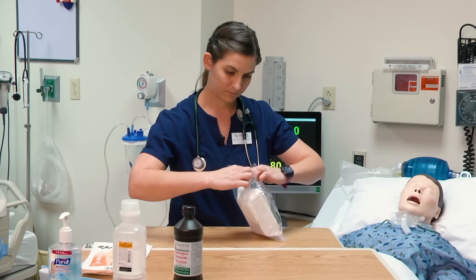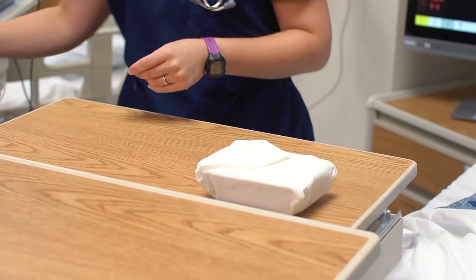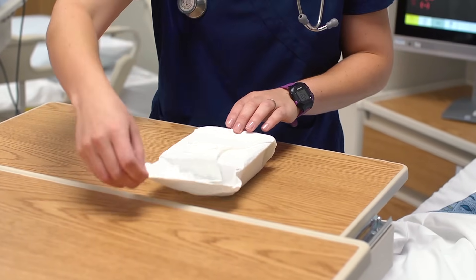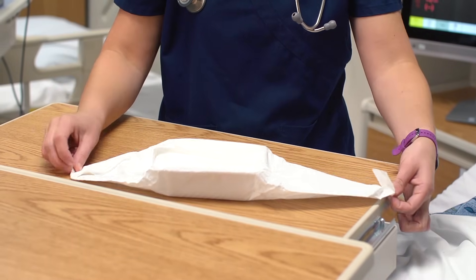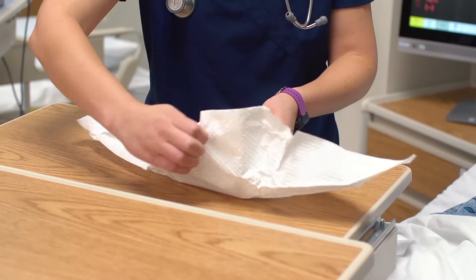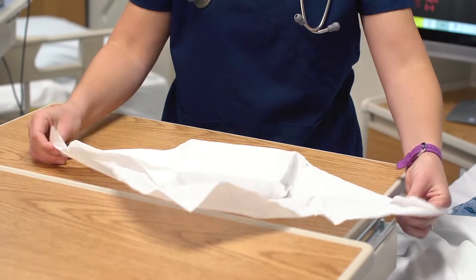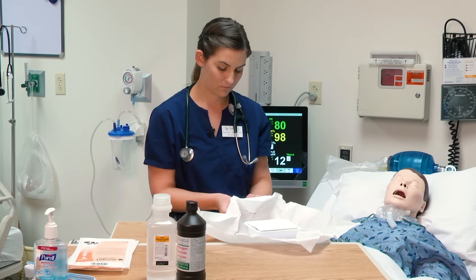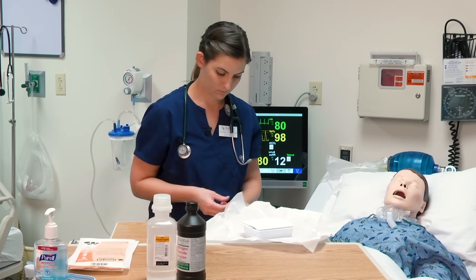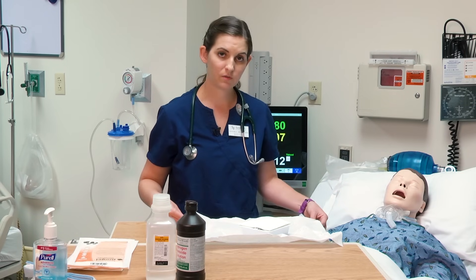I'm going to open up my tracheostomy kit. Remember, the one-inch border around my sterile field is considered non-sterile.